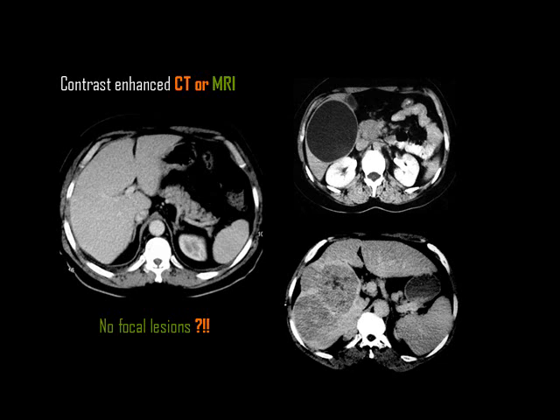Hemangioma is not exactly a cystic lesion, but it appears in the images as a cystic pathology. Okay, these are the 4 common cystic benign lesions in the liver, with one exception, which is cystic but malignant, which is the biliary cystadenocarcinoma. 4 malignant lesions in the liver that are common.